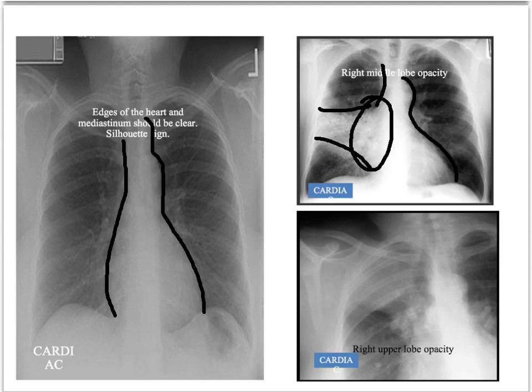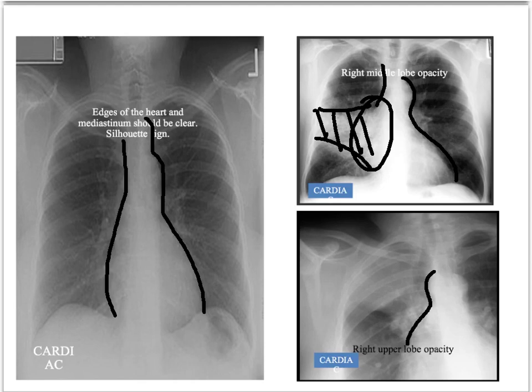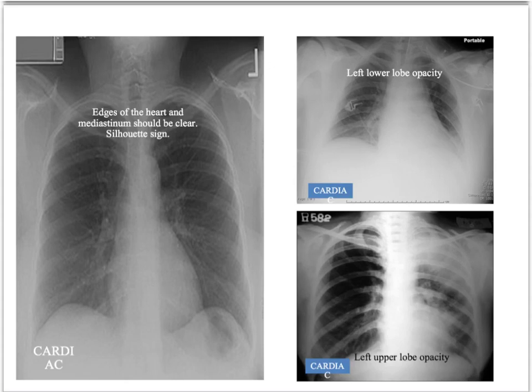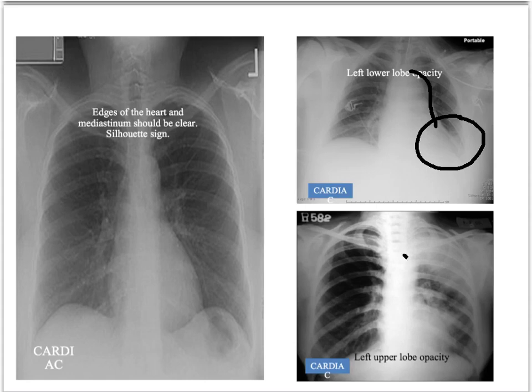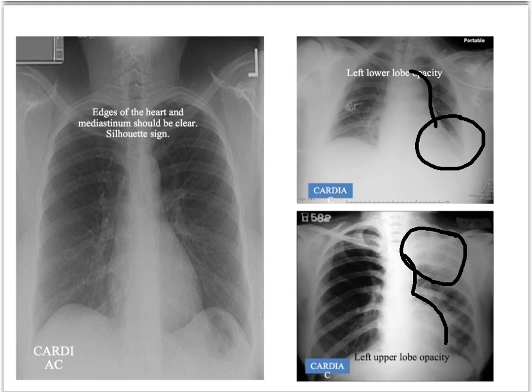If you're not sure whether you're dealing with consolidation, fluid, or oedema, you can describe it as an opacity — this area is simply more opaque than the rest of the lung, so it's a right middle lobe opacity. Another example shows a right upper lobe opacity where the silhouette is again lost. On other examples, a left lower lobe opacity causes loss of the lower heart border, and a left upper lobe opacity causes loss of the upper border. The silhouette sign is a very strong indicator of pulmonary pathology.